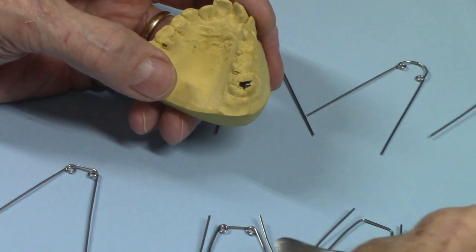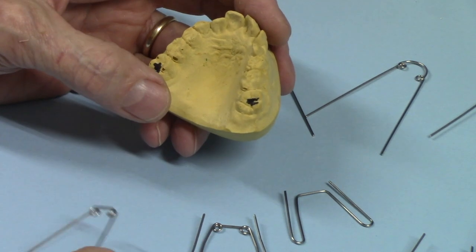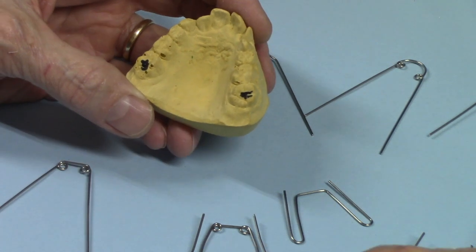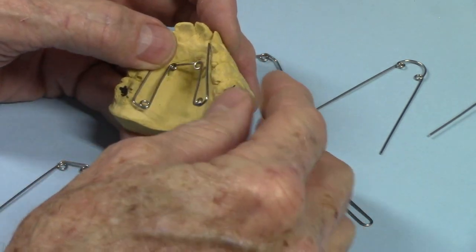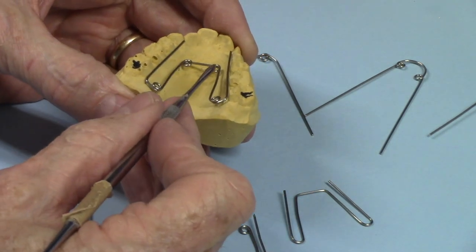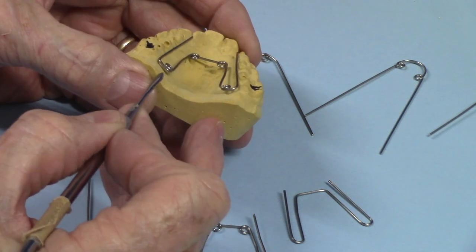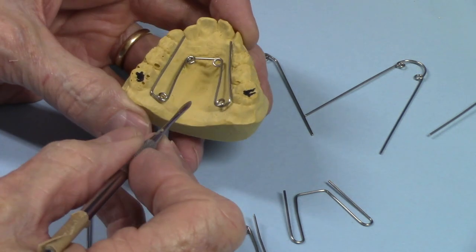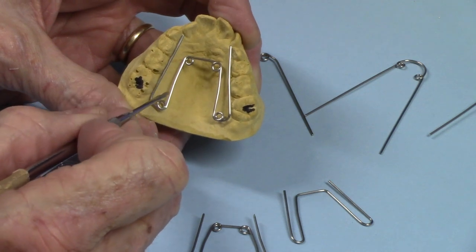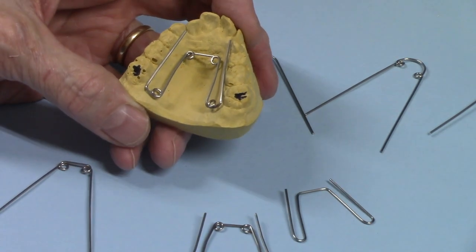So when a doctor sends me just a model — a doctor I don't know — sends me a model and says make me a quad-helix, I get on the phone and say, let's talk about it. Which way do you want it done? For instance, in the distal you've got this design where these anterior helices are parallel with the occlusal plane, but when you get back here they're kind of turned a little sideways. This is the way this doctor likes it. But I just make it the way they want it done.